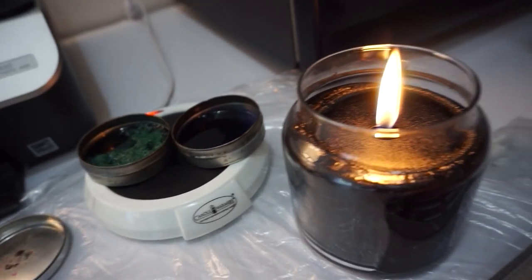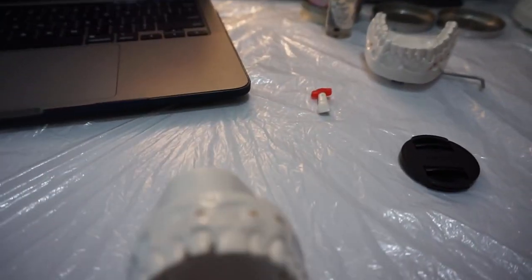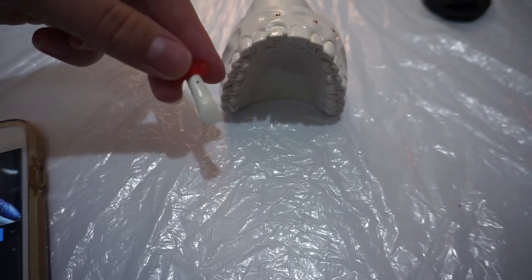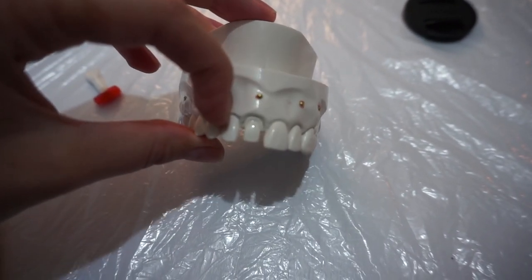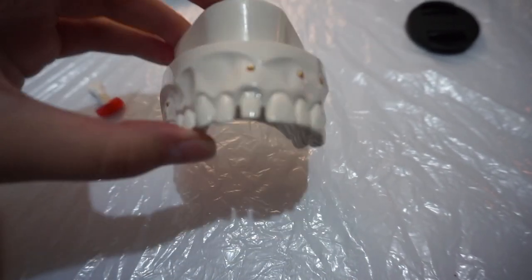So the wax is almost melted. I have this flame because we don't get Bunsen burners, but hopefully this will help heating up instruments. So we're doing tooth number 8. It's that one that I removed, which I just have here as a reference. But yeah, you basically pull this little pin out and then put in the kind of crown prepped one, and then you're gonna build it up. Build up the anatomy with the wax.